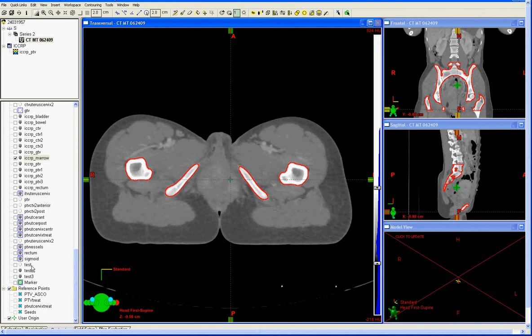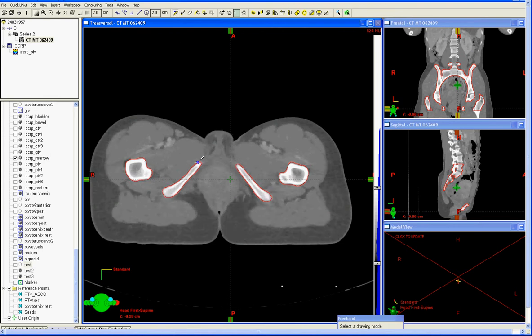There are a few methods available to outline the bone marrow. One approach is to directly hand contour around the bone, like so, on every third slice or so, and then interpolate. That's one potential method.